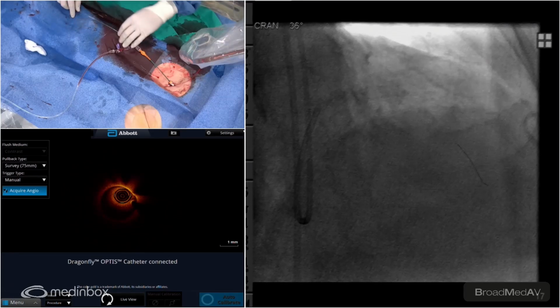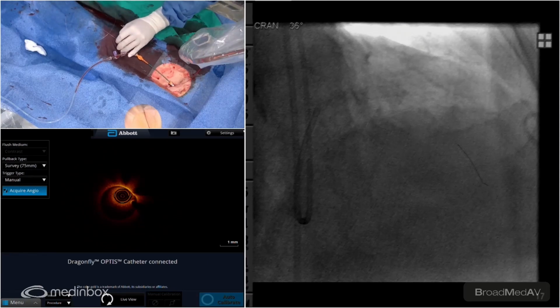Sorry about that, Sheila. I'm knocking people around here. Straight. Okay, got the wire here now. Okay, so keep going a bit more. There we go. Let's have the Rotaglide running. Yeah, let's get some safety, some assessment flow going. Rotaglide open. Perfect. Wide open. Yep. Slow that down a bit. There you go. Give it a try. All right, you're high up already there. Okay, we'll spin that. We'll do our test spin.